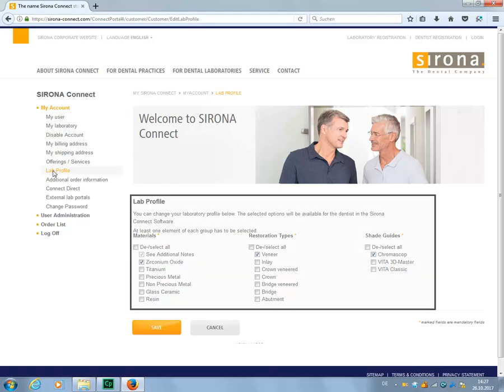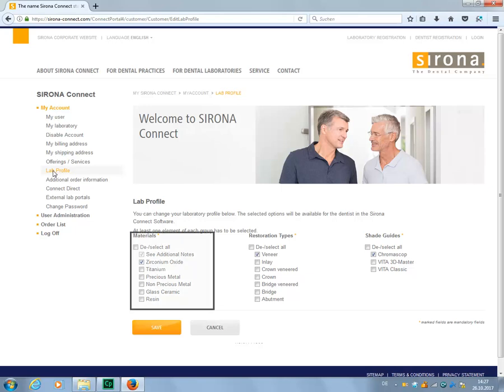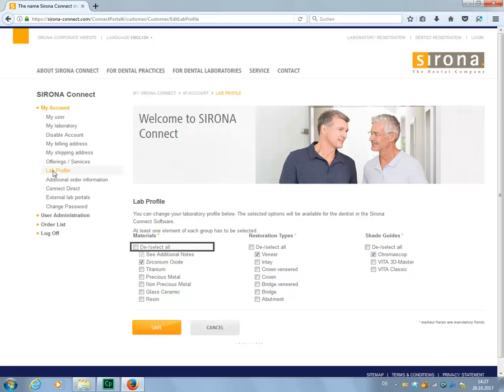In the lab profile submenu, you can start implementing the first default settings that are visible to the dentist in the Serona Connect software. These include the selection of materials processed in your laboratory, the various restoration types, plus different shade guides. Enable the Select All checkbox if you process all the listed materials. The option Additional Notes is always active and means that if no material is selected during the order process, further information must be specified by the dentist.